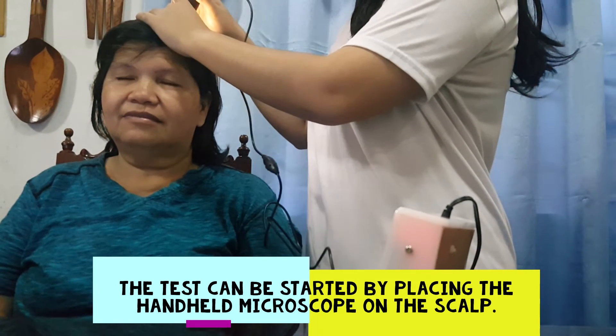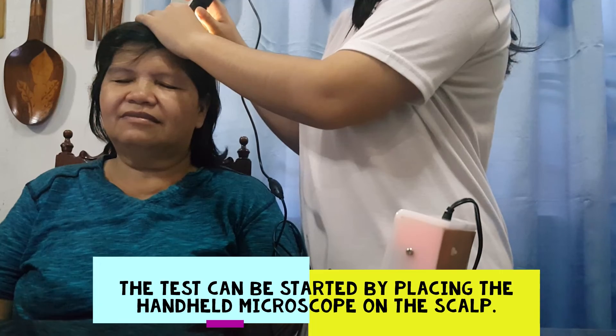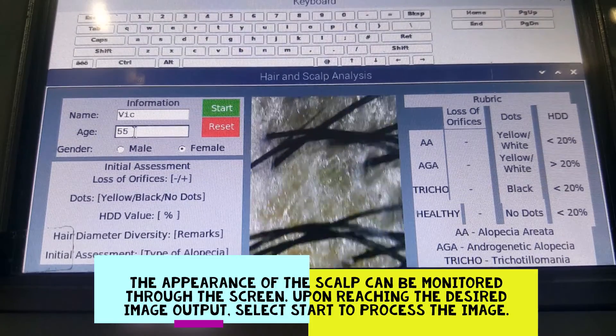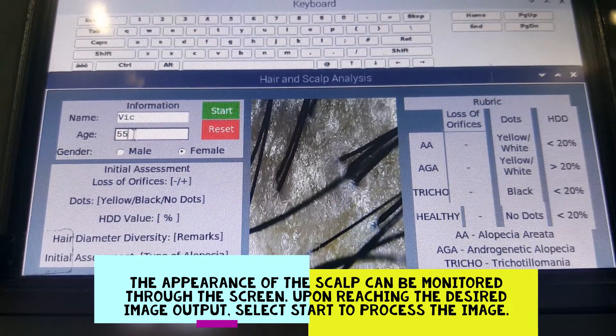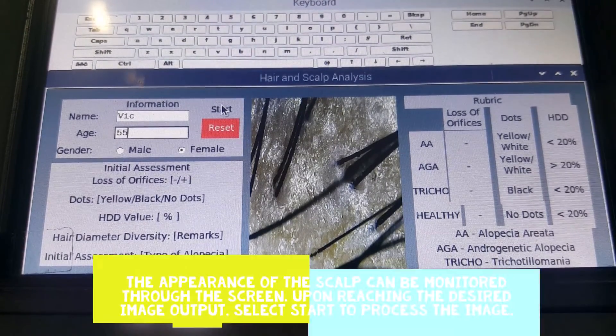The test can be started by placing the handheld microscope on the scalp of the patient. The appearance of the scalp can be monitored through the screen. Upon reaching the desired image output, select Start to process the image.